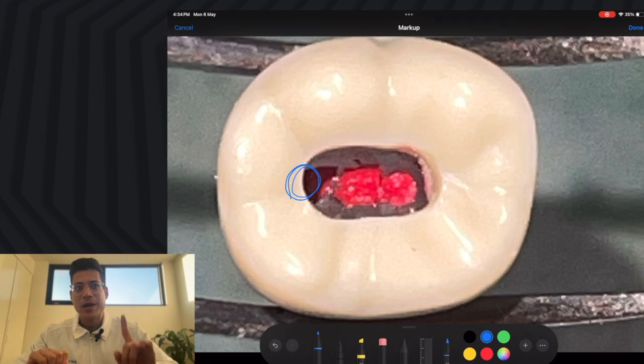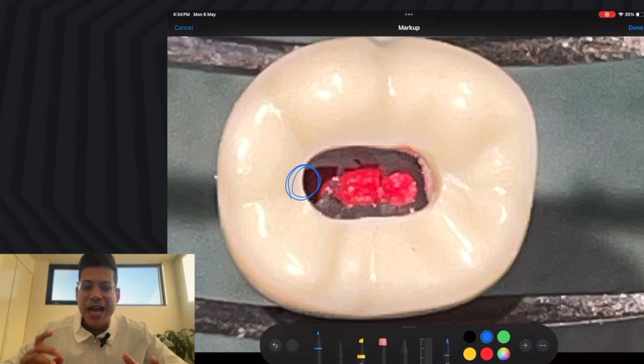It's going to teach you about the upper molar, lower molar, premolar, and some bonus content and bonus videos on how to refine the cavity. When you finish your endo, how to know that you've removed enough, you've removed too much, and where is that middle line where you say that this is bingo, I'm 100% passing the exam.